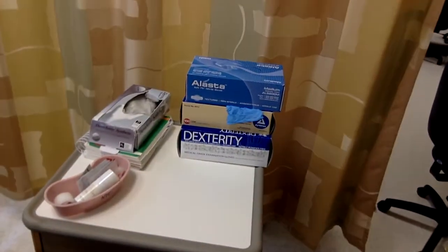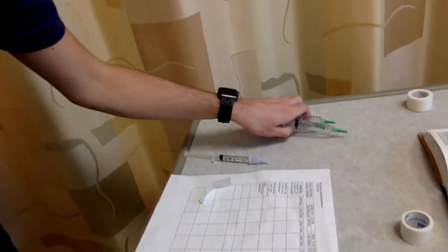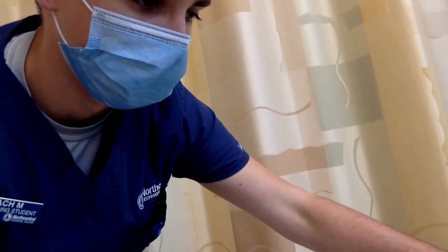Alrighty, so I'm going to be doing my IV medication administration. So here's where my computer's going to go, so there's nothing on there I can cheat from. Nothing by the mannequin. Nothing on me. And then here's my workstation with all my supplies. So I got my MAR, my medication, 3 syringes, tape, alcohol swabs, gloves, and then the Betty book so I can check for compatibility and the push rate. Let's get into it.